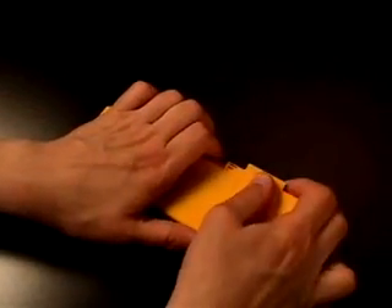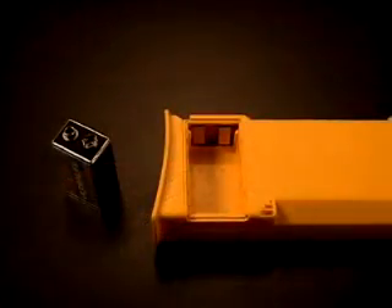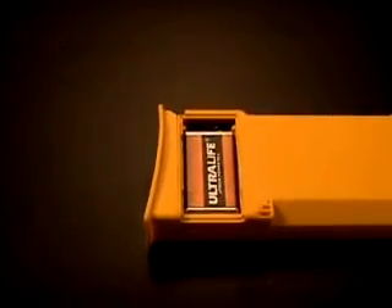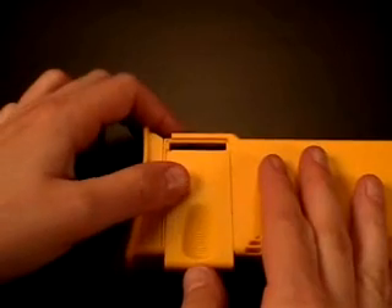To access the 9-volt battery, remove the 9-volt battery door by pushing on it sideways. Remove the 9-volt battery by gently tapping the battery pack. Insert a new 9-volt battery so that the contacts on the battery touch the contacts in the 9-volt battery compartment. Replace the 9-volt battery door by placing it in the almost-closed position and pushing it closed.